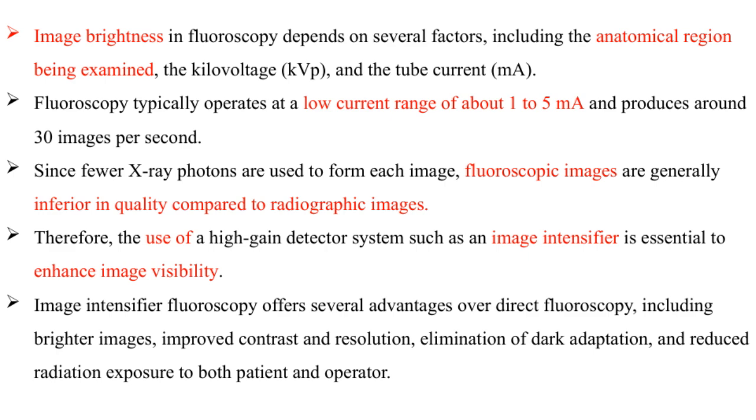Now, when comparing image intensifier fluoroscopy to direct fluoroscopy, there are notable advantages. Image intensifiers offer brighter images, improved contrast and resolution, and they eliminate issues like dark adaptation, which can occur with traditional systems. Most importantly, they reduce radiation exposure for both the patient and the operator, aligning with our overall goal of safer imaging practices. Understanding these factors helps us optimize fluoroscopic imaging, ensuring better diagnostic and therapeutic outcomes while maintaining safety.